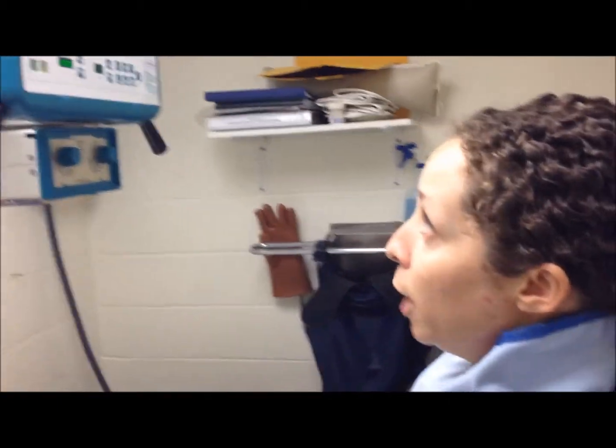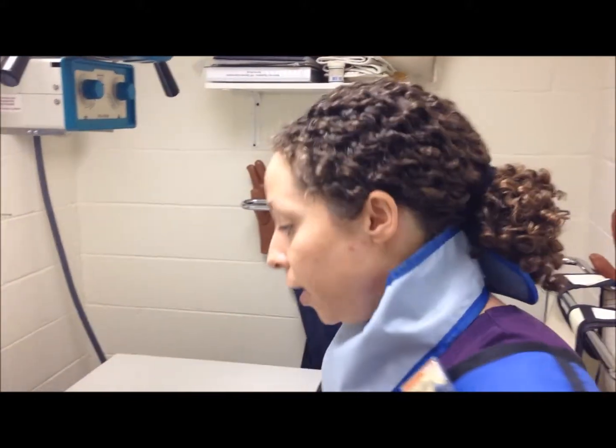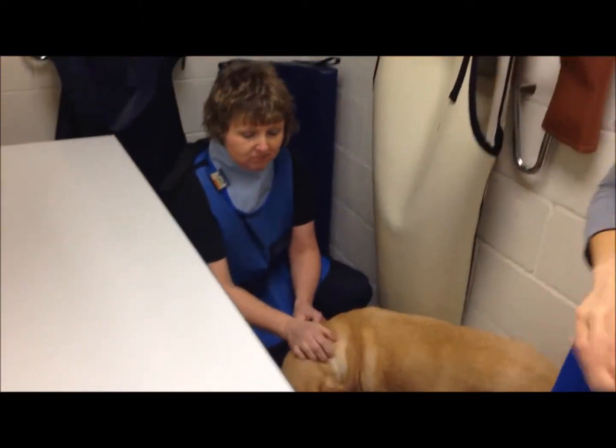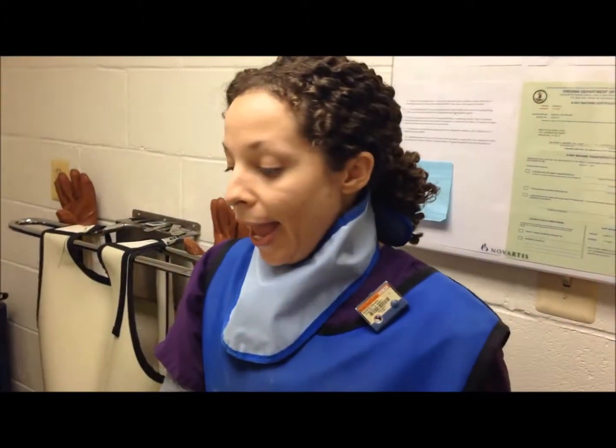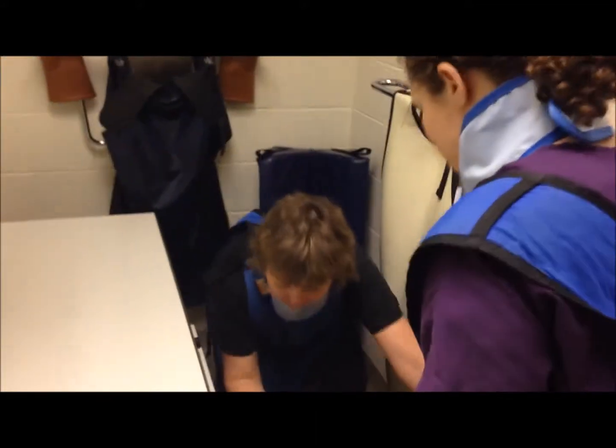So we're going to start at 6.4, and obviously we're going to be making any kind of adjustments that we need to our kVp and our mAs based on the results of the x-rays that we're going to take. So once we get Reese into position, you take 2 exposures at the setting, and based on how they look, that's when you make your adjustments to your kVp and your mAs. So we're going to go ahead and get her into position first.